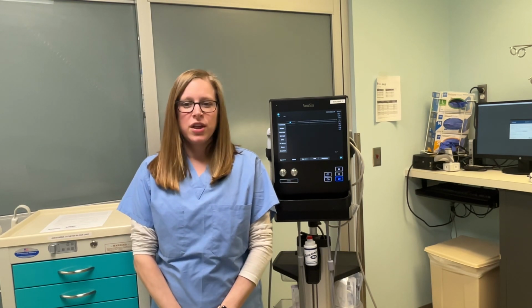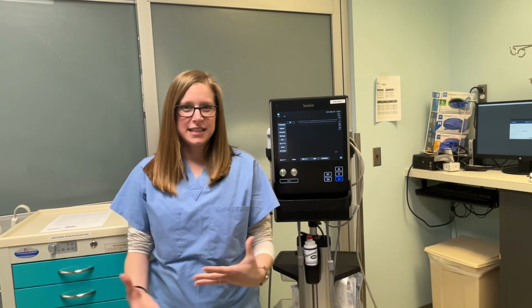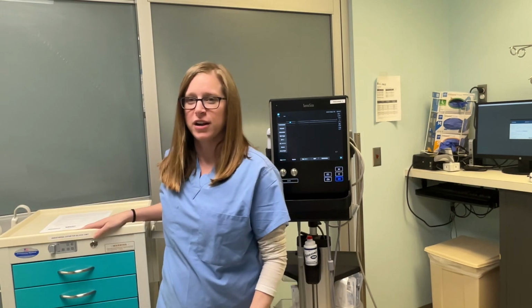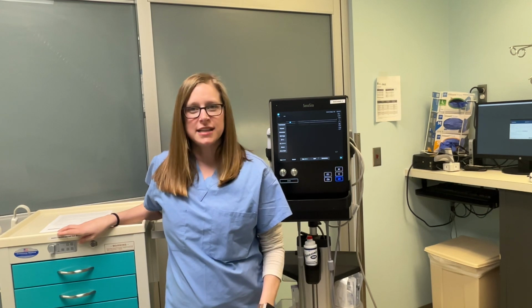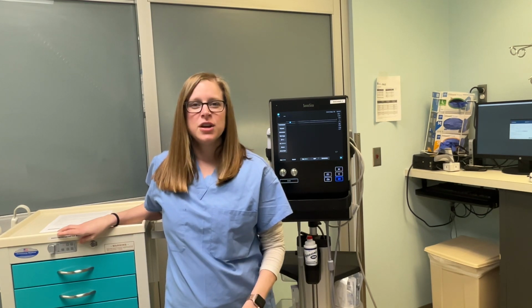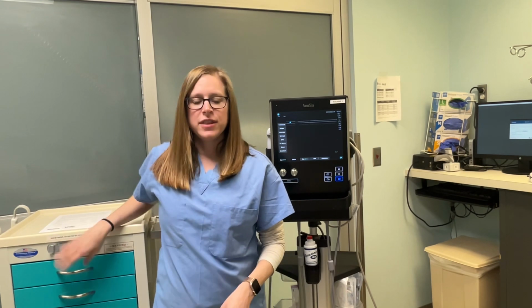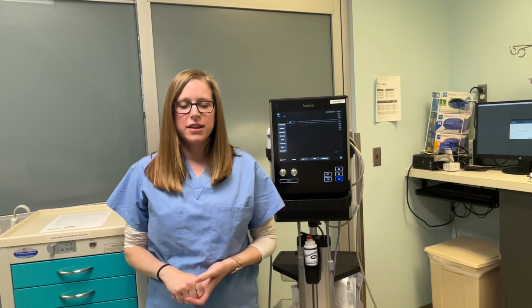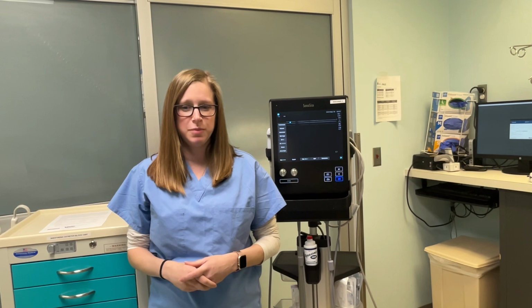block nurse. The block nurse will need to get a couple of things together for the procedure. The first will be the ultrasound and then also the block cart, and you can get these from Holding. You'll also need a bedside table for anesthesia and possibly a second for positioning of the patient. If the catheter is going to be done in PACU, a focus report will be obtained by the nurse and 2 people will transport the patient from their room in a bed to PACU.